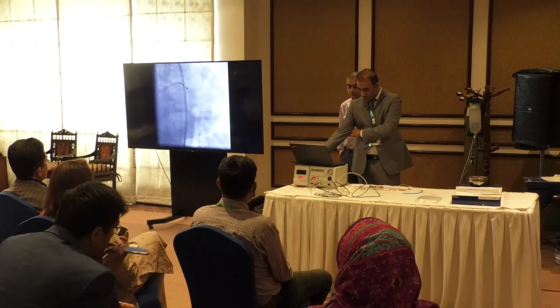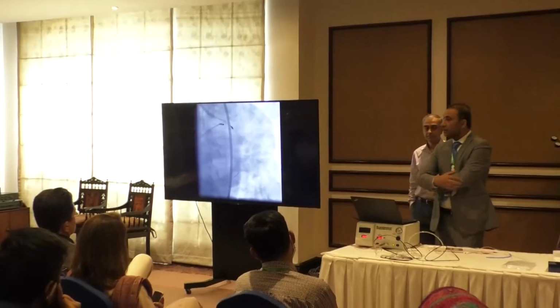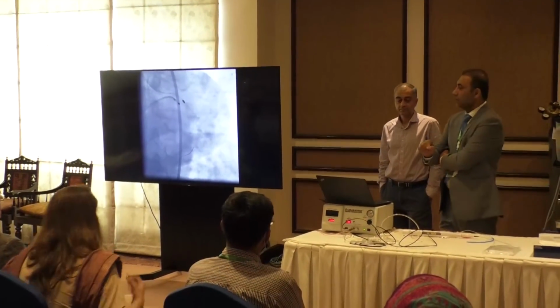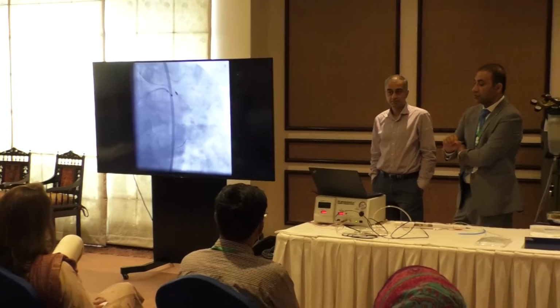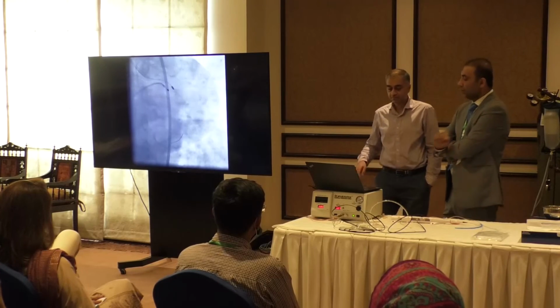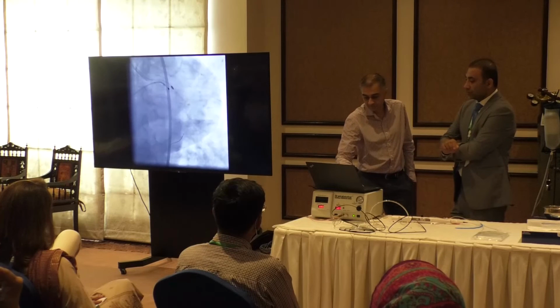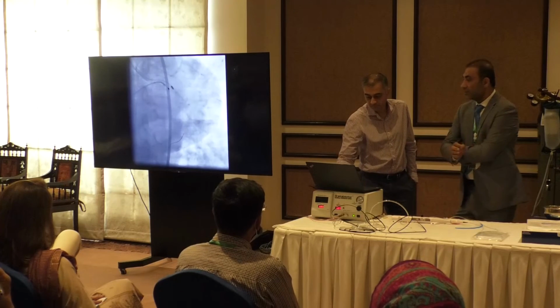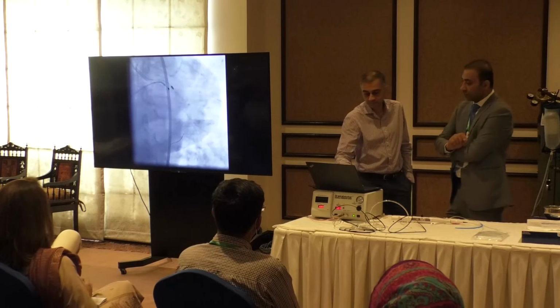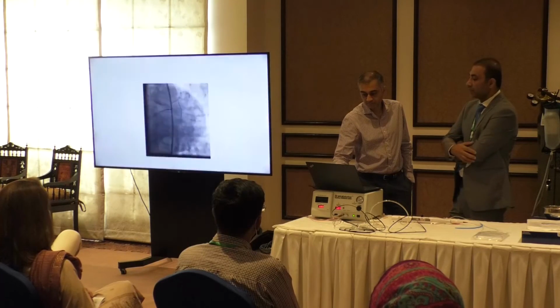So you can see in this video some steps. This is the pecking motion, you can say. You should not force the rotor, and you should not cross the lesion in one go. You slide the knob gently, and you should not rotablate for more than 10 seconds. Each time you have to hit the lesion and come back. You should not cross the lesion. So this is the concept of pecking.